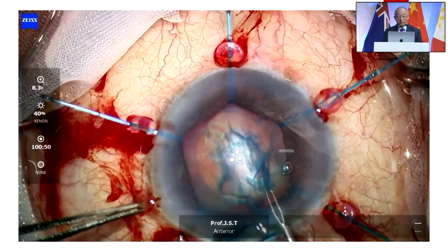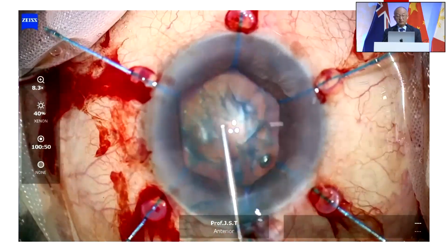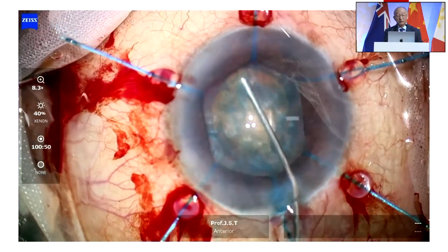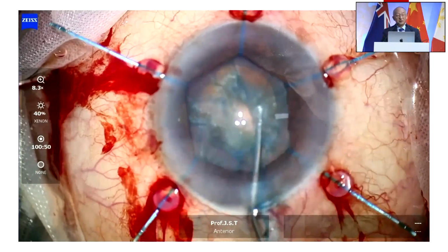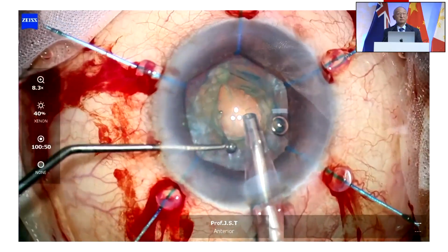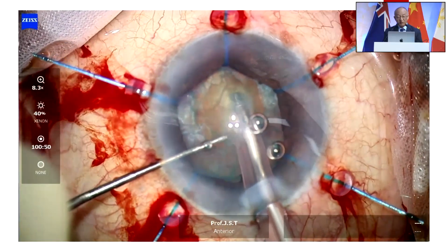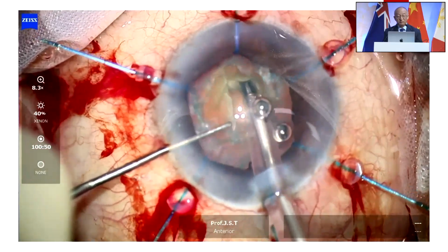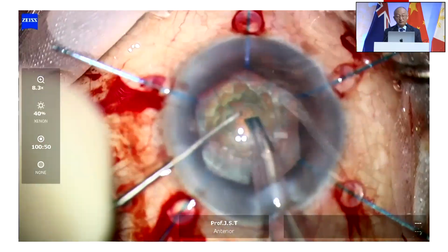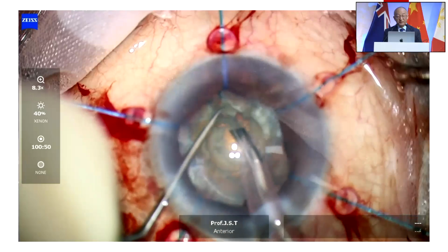This is a micro forceps, a vitreoretinal internal limiting membrane peeling forceps we normally use for doing these procedures. Do a good hydro procedure. Rotate the nucleus, because in small pupil, sometimes nucleotomy becomes easier, but removing the epinucleus becomes very difficult because you leave a large epinucleus in these cases. So first I take out all the loose cortex and make a little trench. This is a grade 3 to grade 4 nucleus. Once you have this trench, you now have a good hold of the nucleus. You can chop it better now.